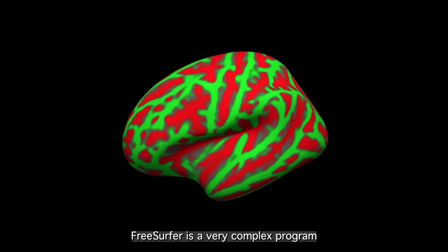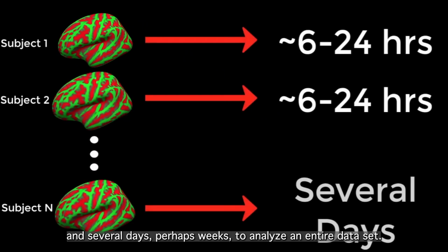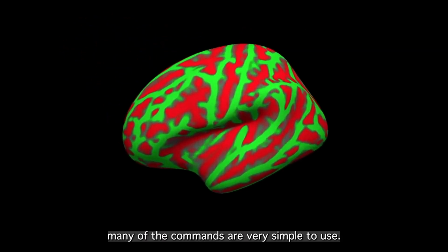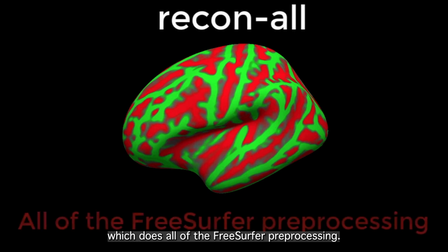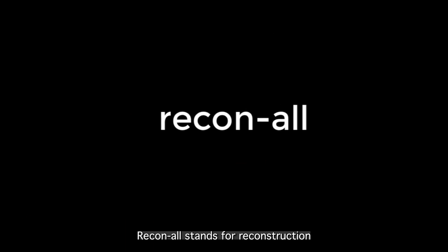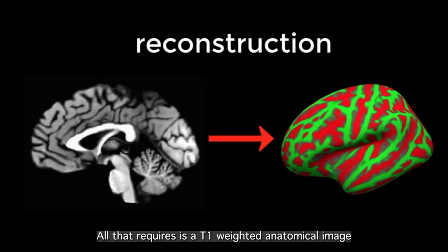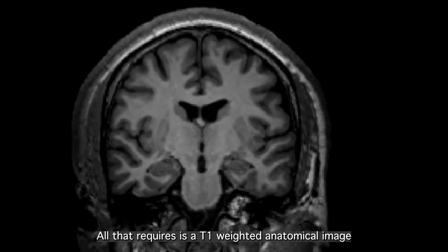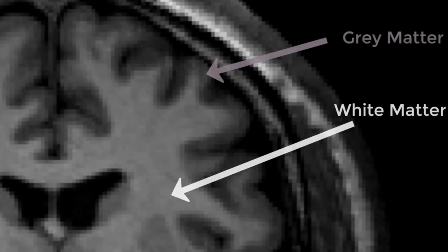FreeSurfer is a very complex program, which can take several hours to process a single subject, and several days, perhaps weeks, to analyze an entire data set. At the same time, many of the commands are very simple to use. This video will review the command recon-all, which does all of the FreeSurfer preprocessing. Recon-all stands for reconstruction, as in reconstructing a cortical surface. All it requires is a T1 weighted anatomical image with good contrast between the white matter and the gray matter.